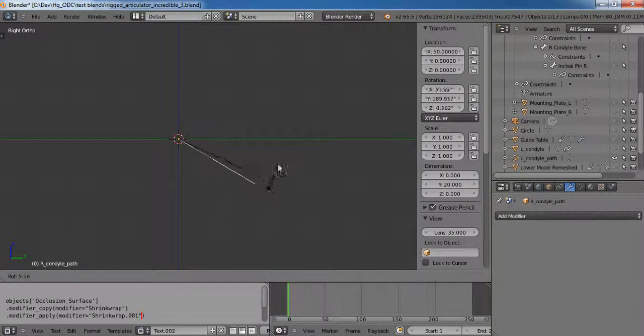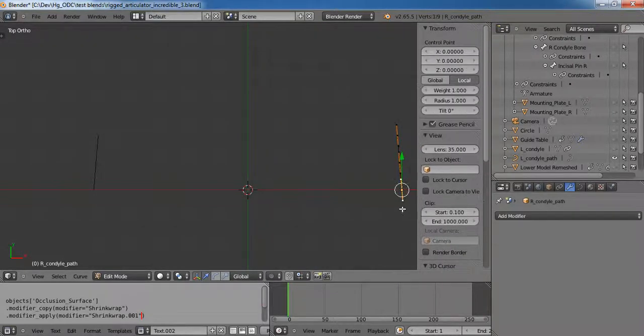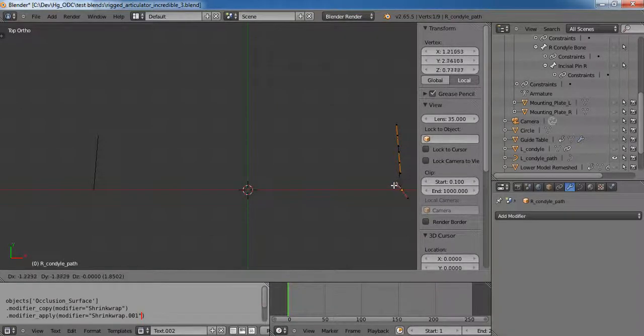rotate any way we like. I've got it at 25 degrees. And then Y being 190 is the equivalent of 10 degrees from 180. So our Bennett angle, if we look at this from above, is 10 degrees. I don't know why this is 190, but that's fine. So you can see over here, we've got 10 degree Bennett angle, 25 degree condylar angle, and the same thing goes for curvature. If we needed immediate side shift, we could get that in there as well. But the takeaway here is that these paths are totally customizable.